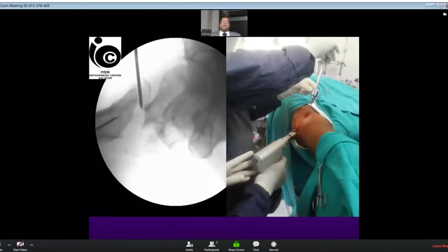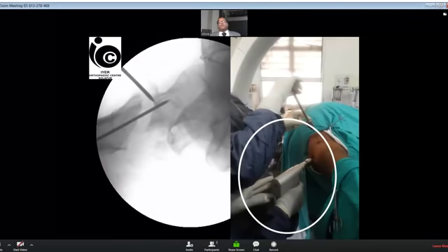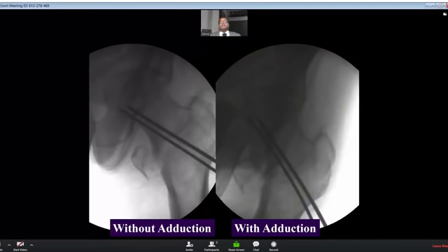Once I elevate, both of them get aligned at the same horizontal level, or the same line, and the neck is aligned properly. Immediately my assistant will drill the K-wire, which was passed partly into the shaft, into the neck. Once the K-wire is passed into the neck properly, if it is coming in the way of the screw or the nail, I'll pass additional screws anterior to that. Otherwise, many a time this fixation is better.